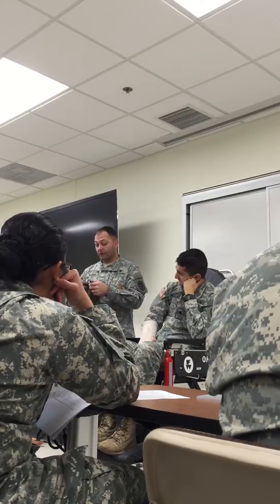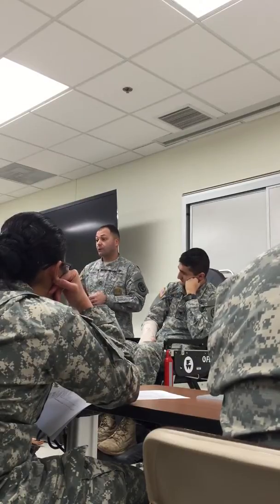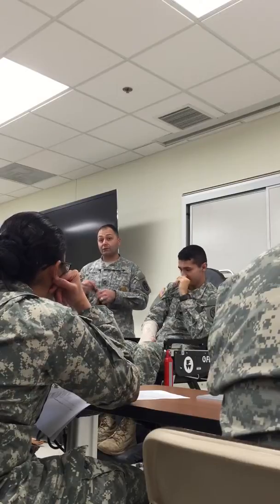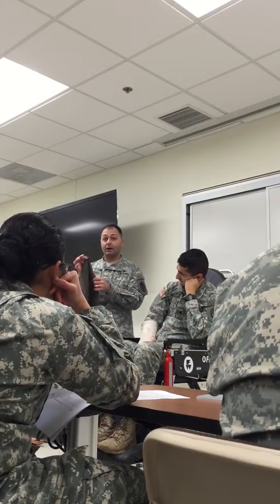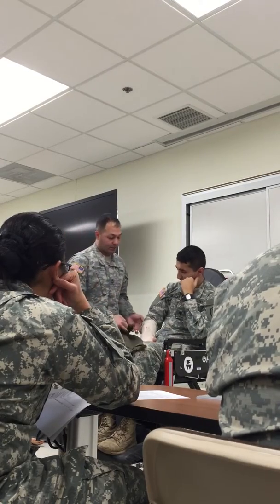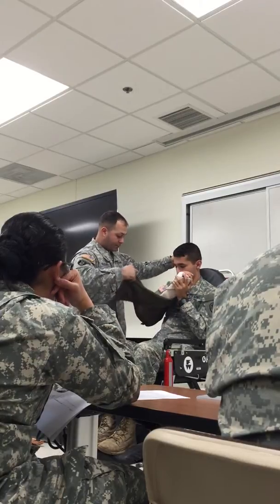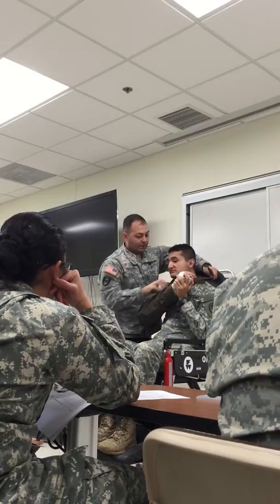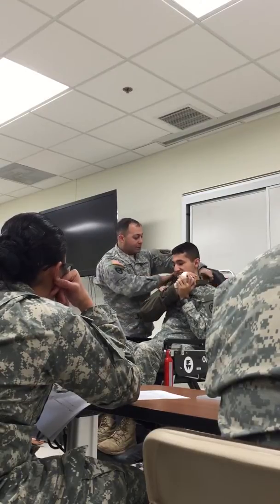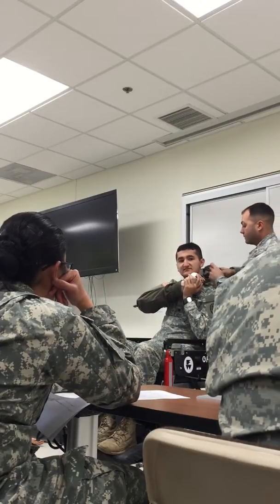The problem with doing it after you've already applied the sling is now you have an arm there that's going to impede you and you're pulling it further and further back. So the best thing to do is to tie it first. And you saw all I did was a simple overhand knot. Twisted and tied. All right, buddy. Making sure to tie your knot on the non-injured side of your arm.